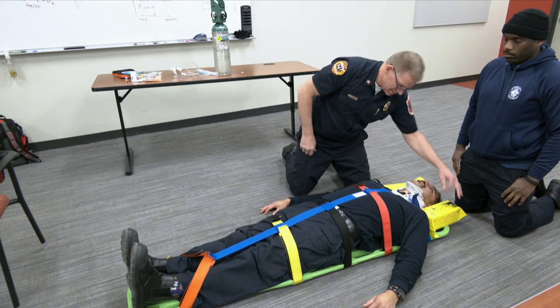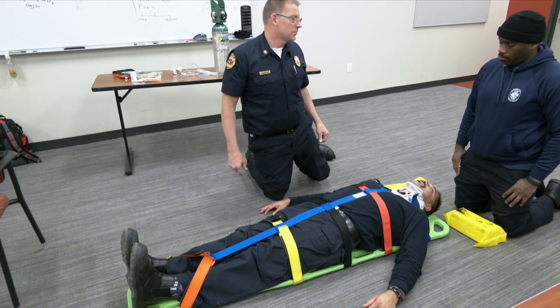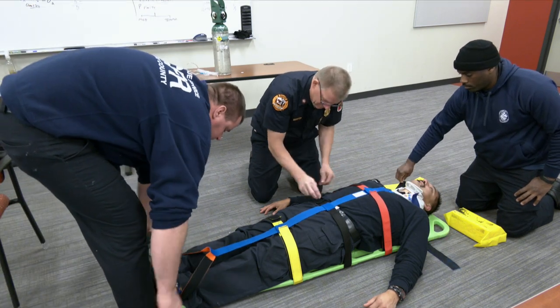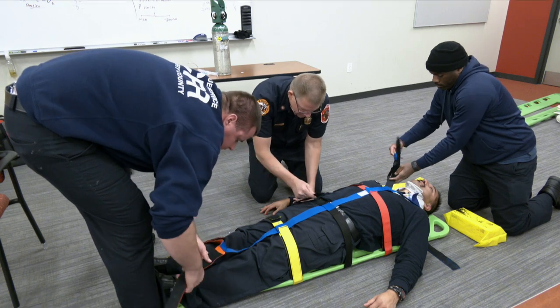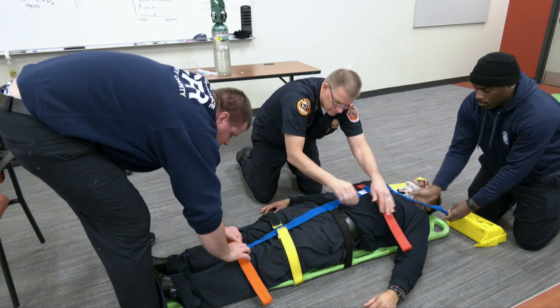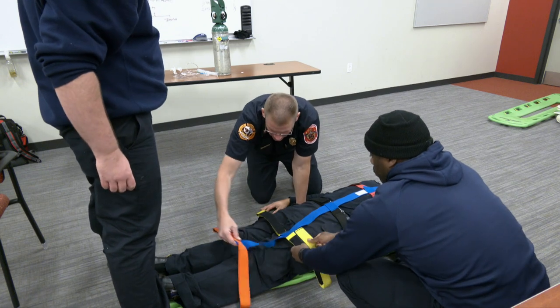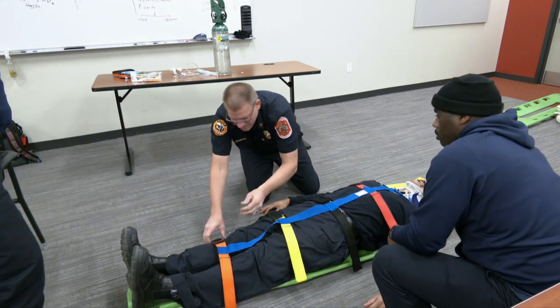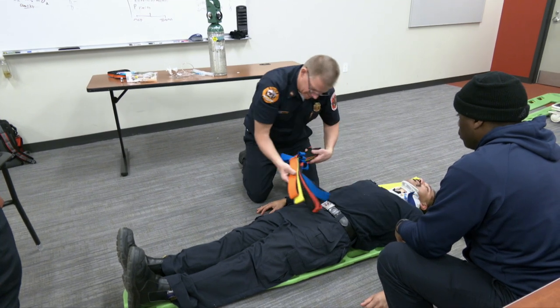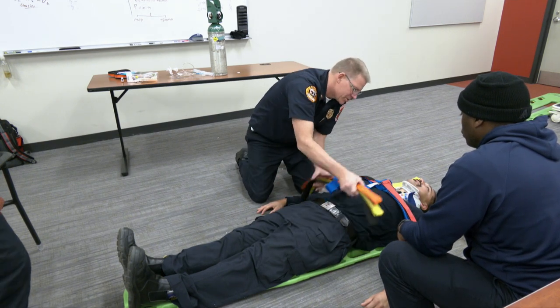Any questions? Then obviously transport and all that. Remember this is a full body splint, so you'll also want to do a pulse motor sensor check afterwards. On your straps — go ahead and get them out — put the strap right back on itself like this, and I'll show you why. When we put our straps away, take one, place it on the other, place it on the other, place it on the other, and fold them together at the top. That way when they come out, we can literally just put it on the patient and drop them down — not rolled up like we had before. Rolling straps is incorrect.